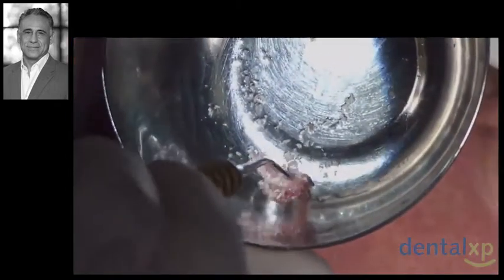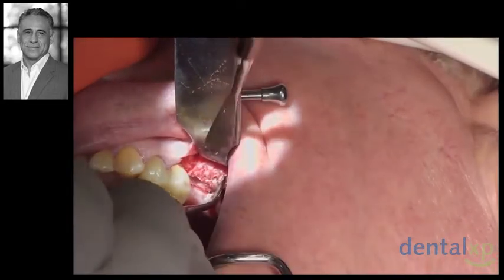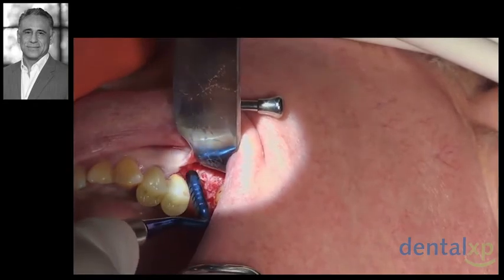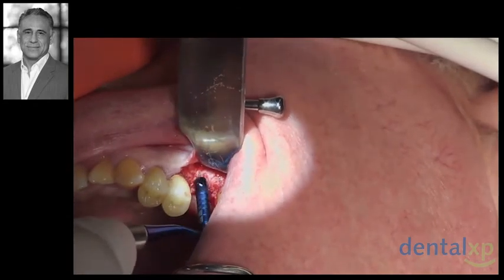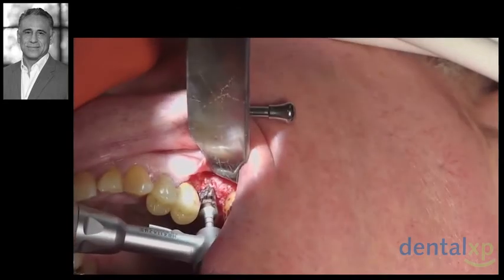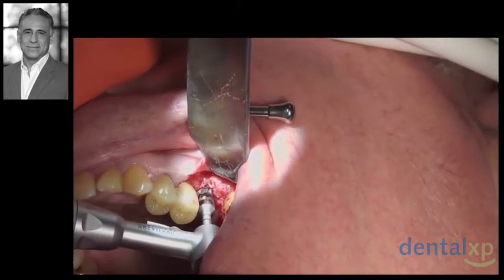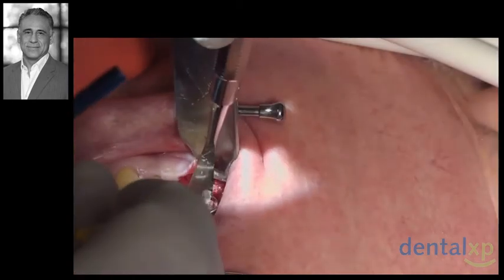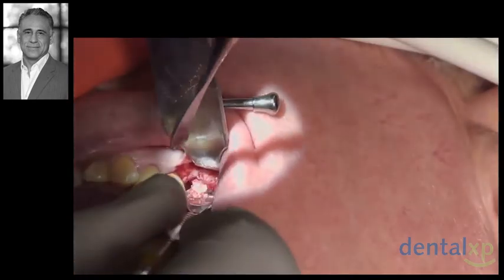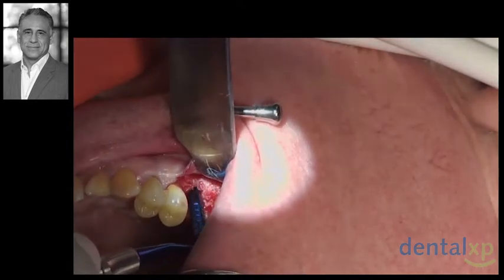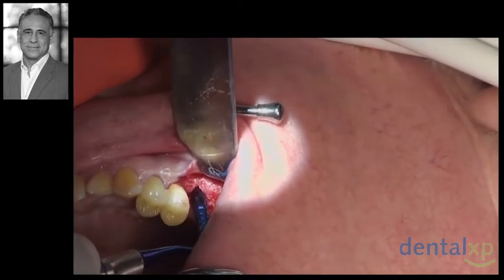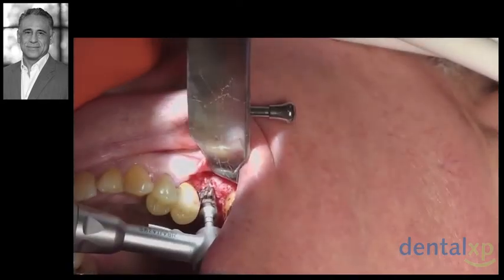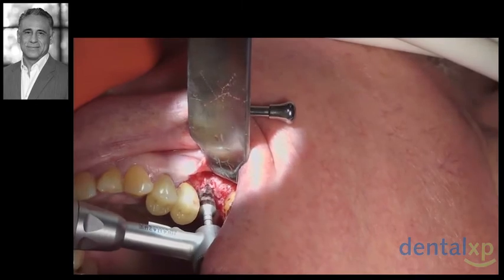Next, we'll place mineralized freeze-dried bone in the osteotomy site and push it toward the apical aspect of the osteotomy using a bone plugger. Then we'll use the last osteodensification burr at about 800 to 1,000 rpm in reverse mode to drive and compact that bone more apically and laterally. This can be repeated again with additional amounts of bone graft until sufficient augmentation and lift has been accomplished.